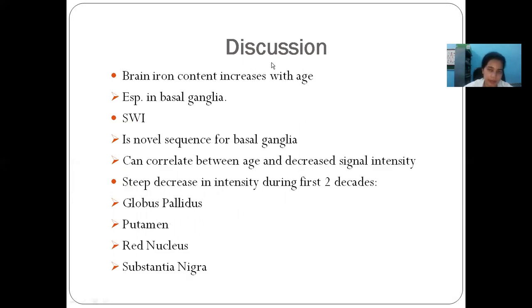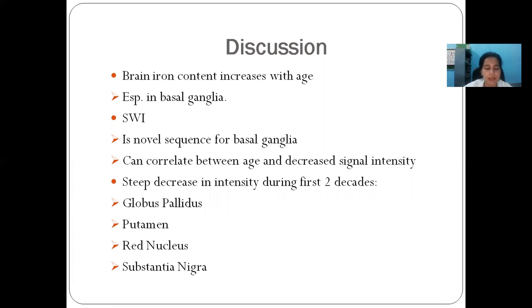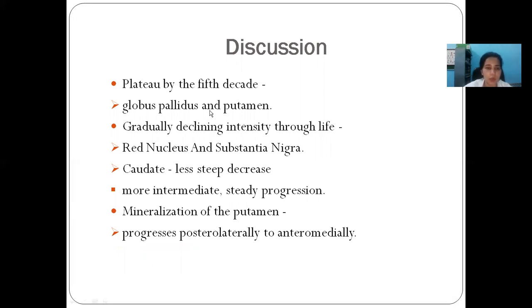In discussion, brain iron content increases with age, especially in the basal ganglia due to their increased metabolic activity. SWI is a highly sensitive imaging sequence that correlates age with decreased signal intensities in different basal ganglia nuclei. A steep decrease in intensity was noted during the first two decades in the globus pallidus, putamen, red nucleus, and substantia nigra, which plateaued by the fifth decade in the globus pallidus and putamen. However, in the red nucleus and substantia nigra, there was a gradual declining intensity throughout life. The caudate nucleus showed a less steep decrease with a more intermediate and steady progression.